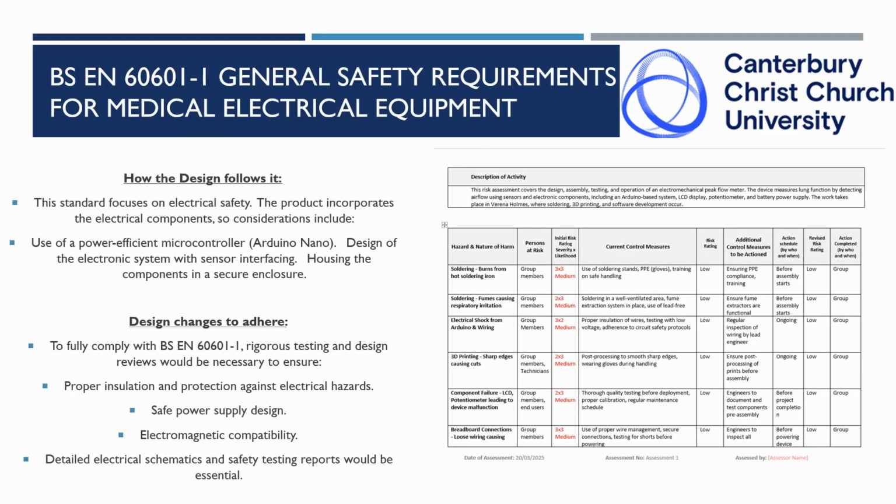BS EN 60601-1: General Safety Requirements for Medical Electrical Equipment. As you can see, we've got a risk assessment on the right hand side, and our design follows this specific industry standard by using power efficient microcontrollers. The entire system was designed in such a way that it strictly adhered to this British industry standard. How we want to further adhere to these standards is proper insulation and protection against electrical hazards, as mentioned in our risk assessment.